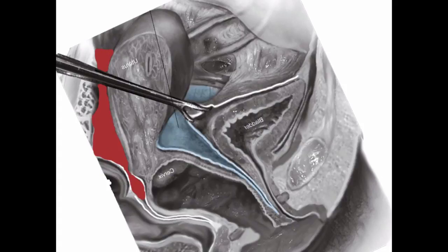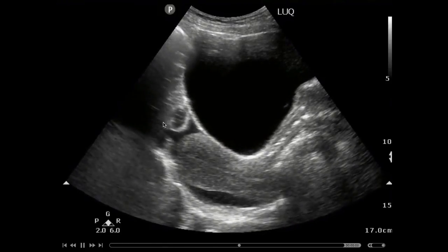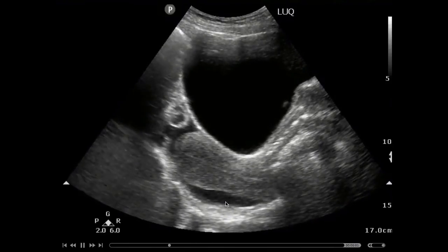If you have a retroflex uterus, the blood might accumulate between the bladder and the uterus. And here's a positive FAST in a female. We have our bladder up here, our intestines moving around right here, a little bit of free fluid here, and a lot of free fluid down here behind the uterus.